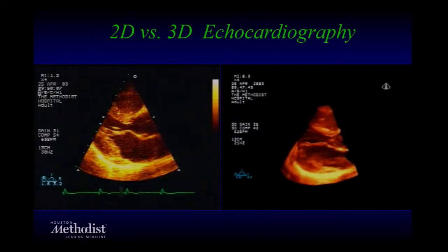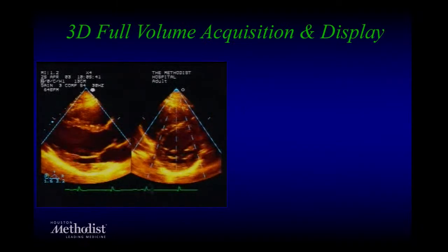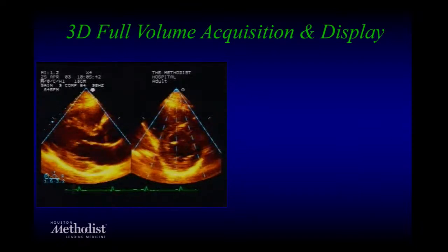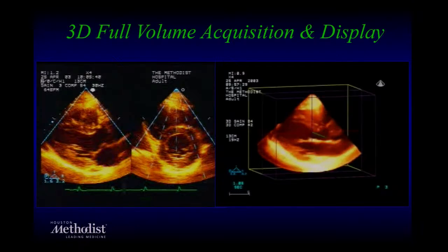And even then, 20 some years ago, you could see that you could actually image the heart. At that time, we didn't have the capabilities to see the whole heart in one beat as opposed to stitching, right? We still do that if the heart rate is fast or you need a better resolution. So you get this blob of 3D and then ask it to cut it in the midst of it, and then you could go from one section to another and quantitate various things.